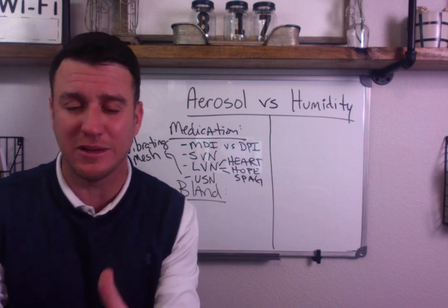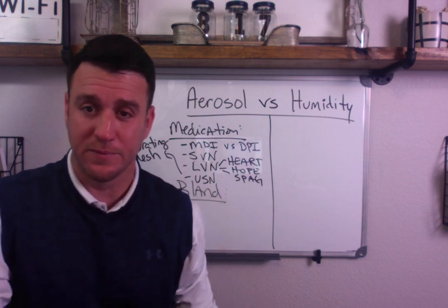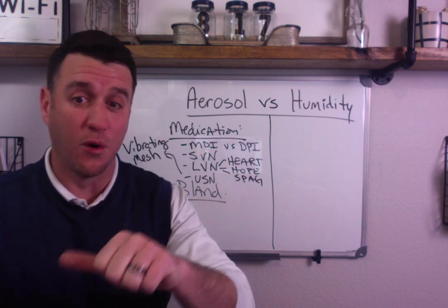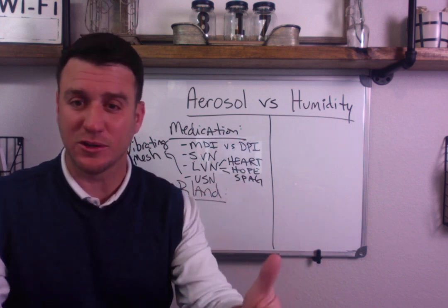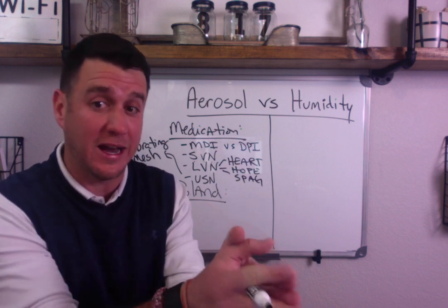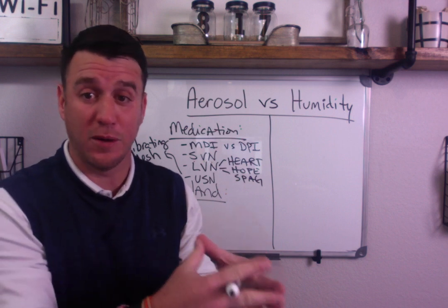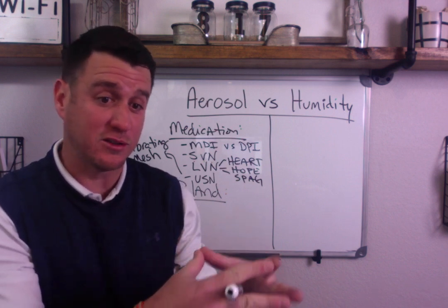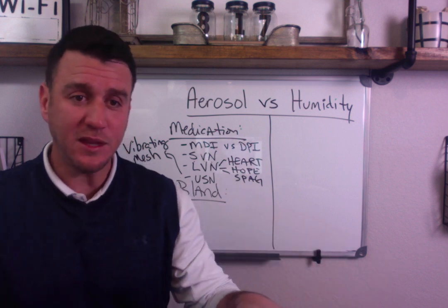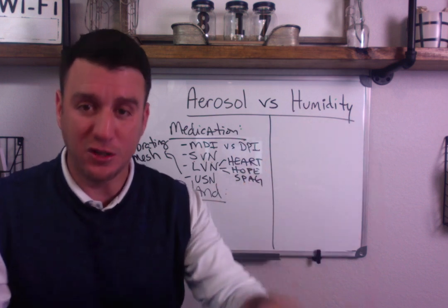I ask this question to my students all the time. I say, you gave an albuterol treatment. What were the effects on the peak airway pressure before and after the treatment? And if they can't answer it, I say, how come you can't answer that? You should understand that you're giving a bronchodilator. You're taking your time as a respiratory therapist to deliver a bronchodilator. Now, if that bronchodilator is effective, meaning bronchodilation happens, then your peak inspiratory pressures in volume control should decrease.